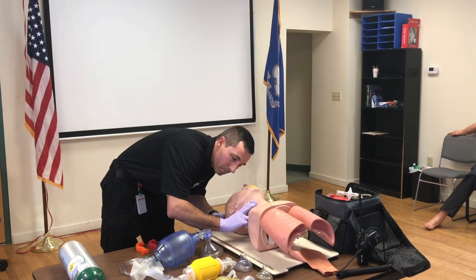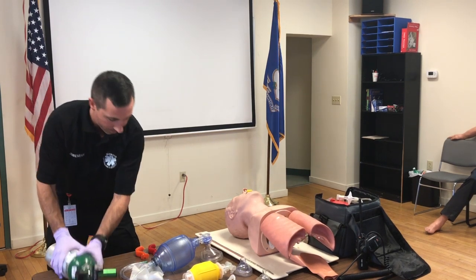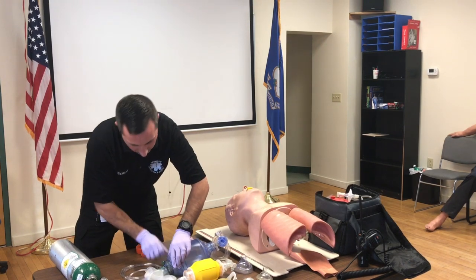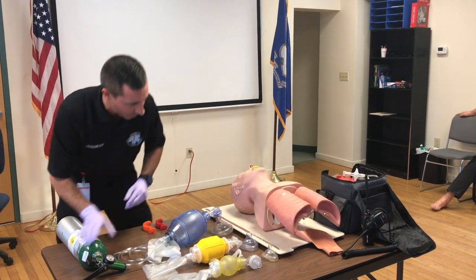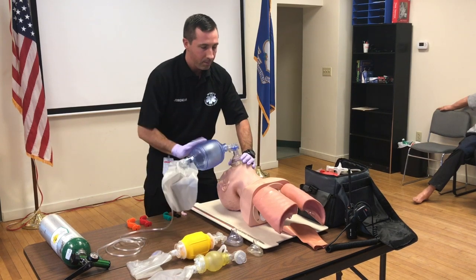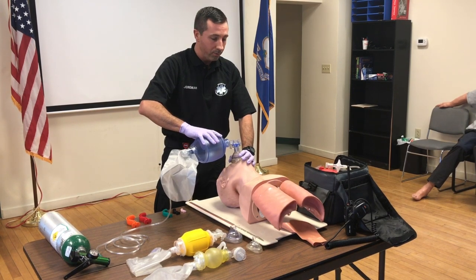Patient's condition is unchanged. All right, so I'm now going to take my O2 tank, turn it on. I'm going to connect my tubing to the bag. Other end to the tank, set it to 15 liters, 100% oxygen. I'm going to reopen my patient's airway. I'm now going to reventilate my patient one breath every 5 to 6 seconds for a full minute.